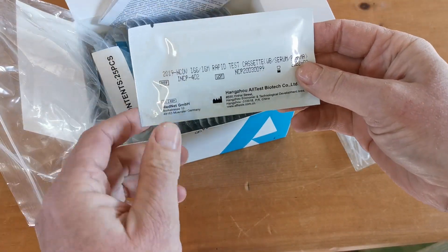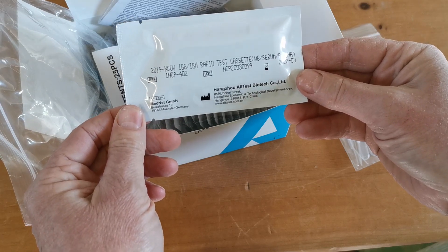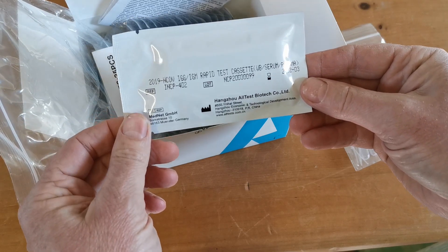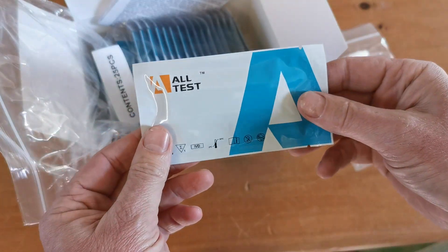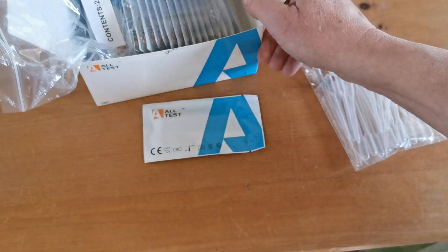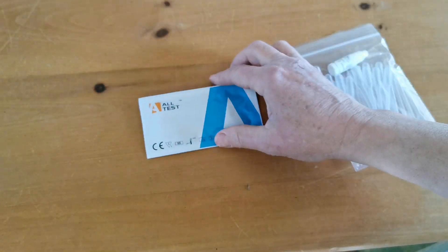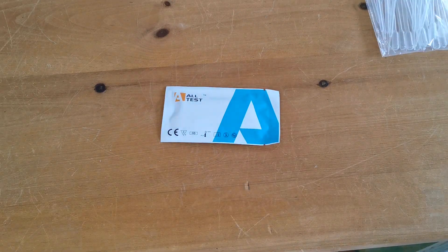Again on the reverse with the full certification marks. This is a CE marked test cassette, and what we're going to do now is run you through the procedure and show you a finger stab or finger prick lancing sample being processed and run through one of these test cassettes. In part two we'll move to that and show you how this test actually works.